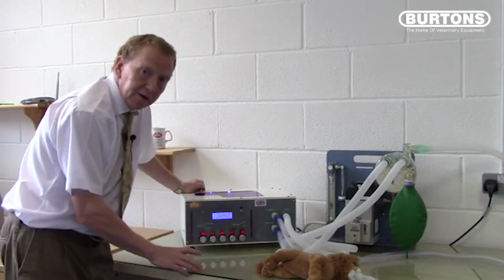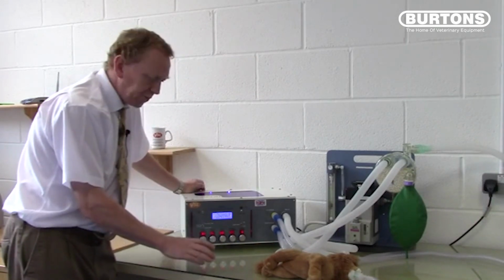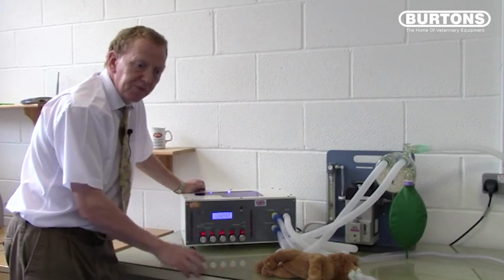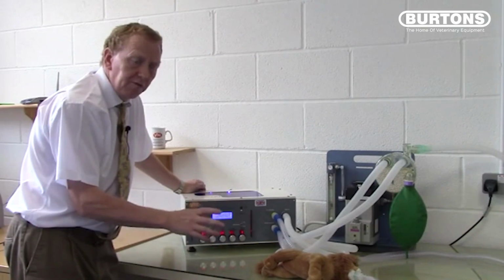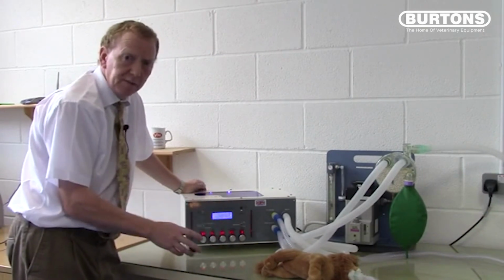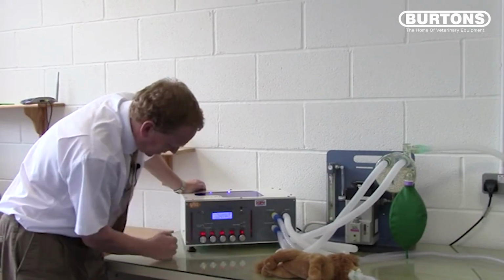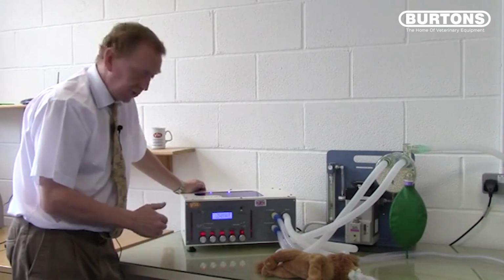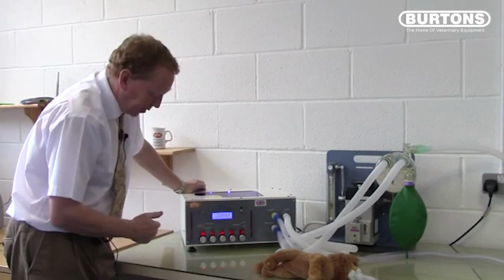The very rough calculation is that 6 litres a minute is 100 mils per second. You'll recall that Leo had a tidal volume of between 150 and 200 mils, so we want to deliver that in about a second, which means we want to set our flow rate somewhere between 8 and 12 litres a minute. So we'll set this to 10 litres a minute, and our expiratory time will remain the same as it was before, because we have roughly an inspiratory time of 1 second and expiratory 2.8.